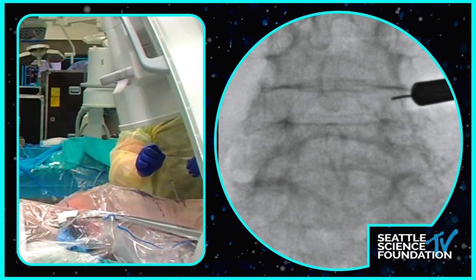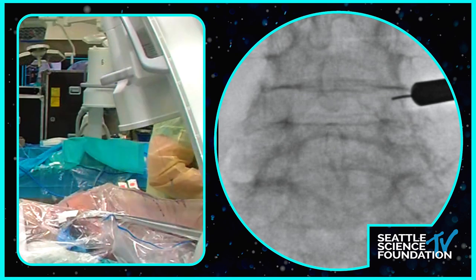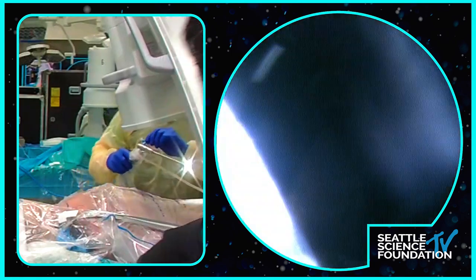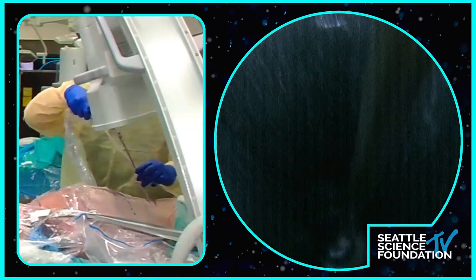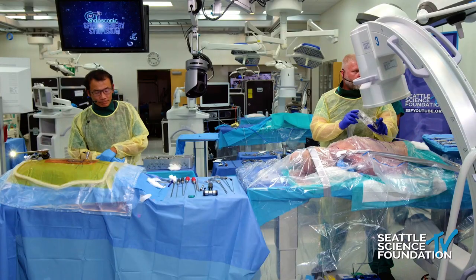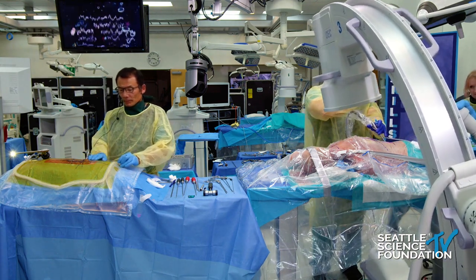At this point, we should be able to leave this in. And give me a scope. Just back the image up a little bit. Ray, do you think it's time we could bring the scope in to see Shen work while you do your foraminotomy, or do you want to keep the X-ray in right now? Sure, we can do that. I don't need to look at X-ray. Come over. So why don't we have the X-ray go to Xian, and then we can have him show us the interlaminar first approach. Now pituitary.